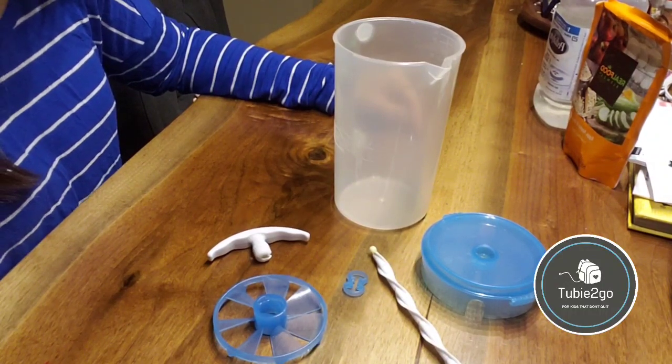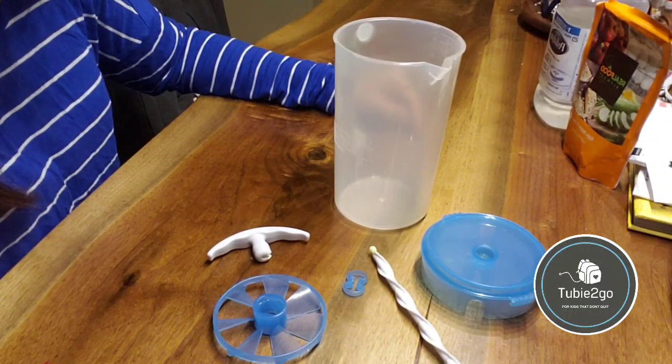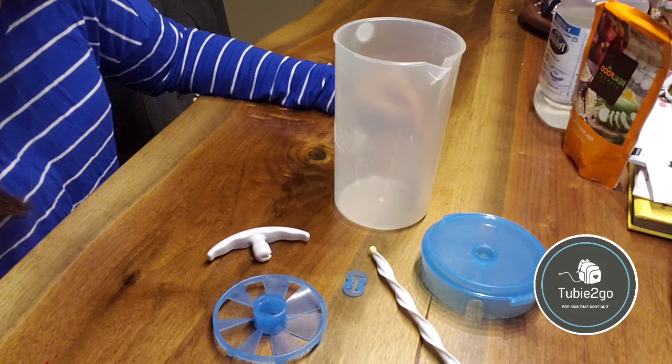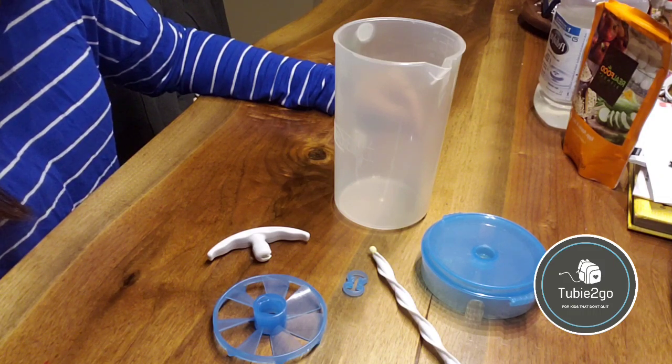Hey guys, in today's tube-to-go video I'm going to do a quick demonstration of the pitcher that we use to mix Magnus's blends. He eats four times a day, so usually I'll just mix the entire pitcher's worth because he only has one pitcher's worth in a day.